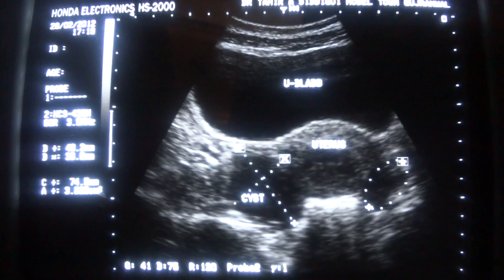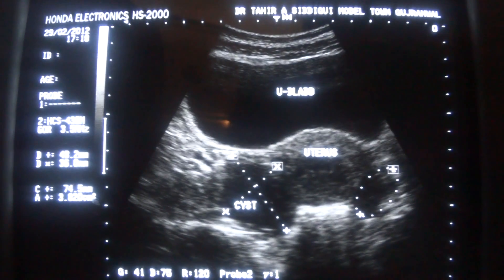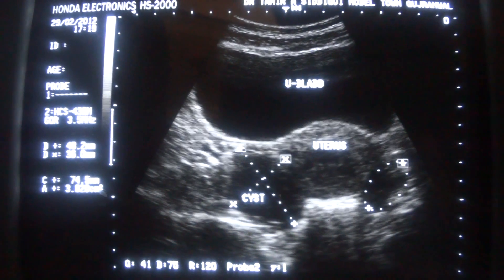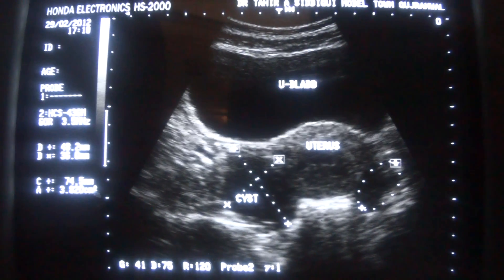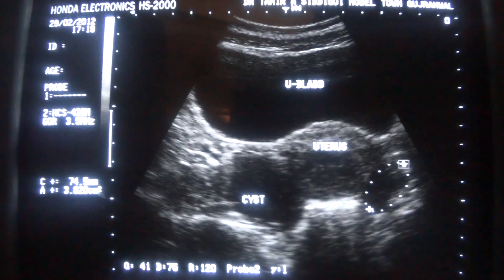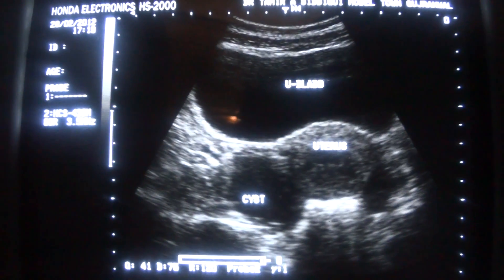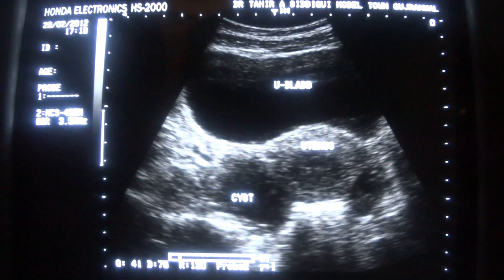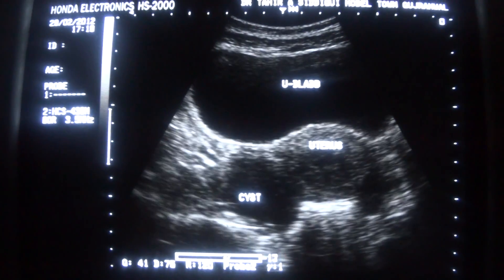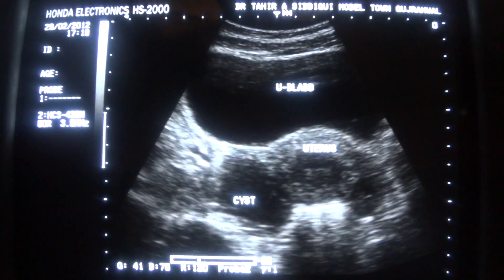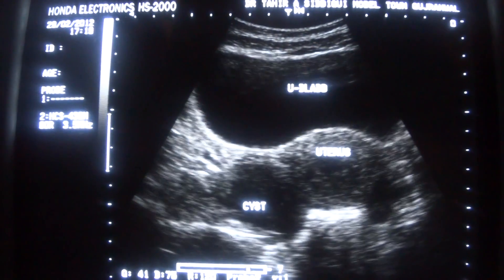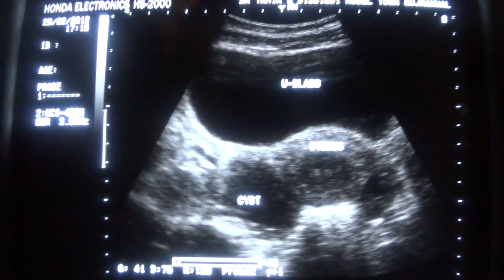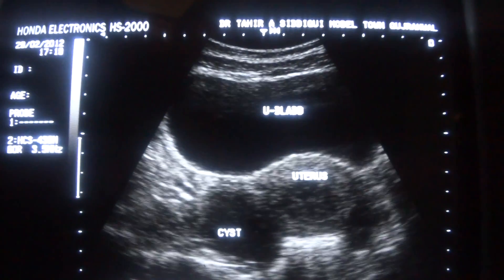In this video segment, the aim of the study was to let you know which cyst is called a retention ovarian cyst. This is an ovarian cyst, but it is retention, simple, and of no significance unless it becomes infected or it increases in size more than 10 cm. No fluid is seen in the pelvic cavity.